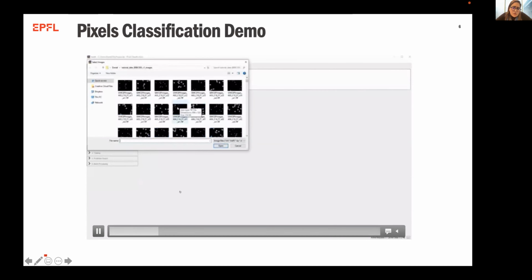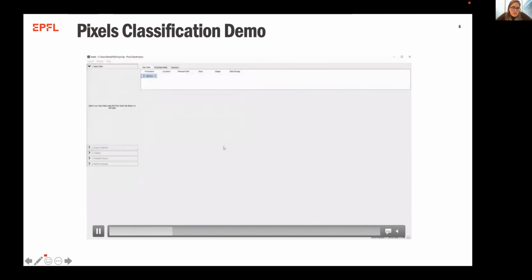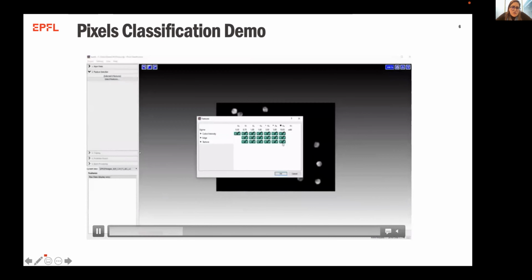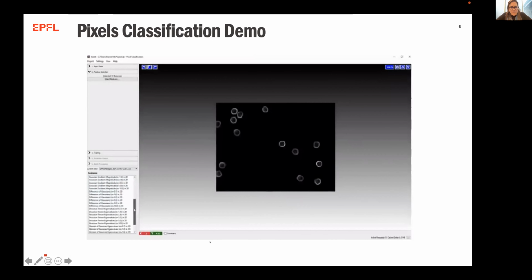But once you select your images, you can then select the different features that are within Ilastik to be able to have a good segmentation. And as I mentioned before, by default, we highly encourage selecting all these features. Once this is done, this is the role of the user, because the user at this stage has a role to define or to label the images.